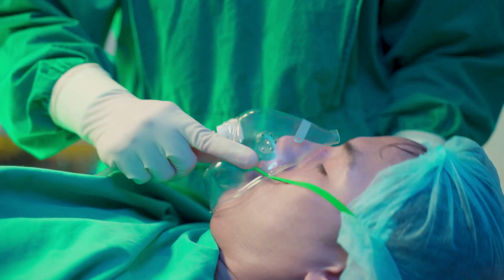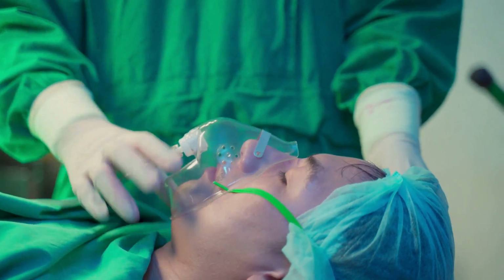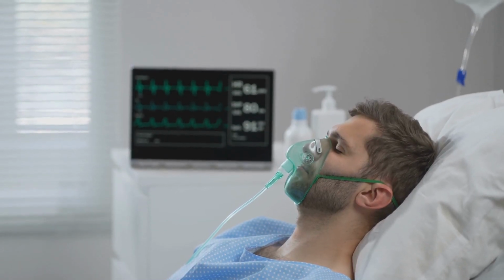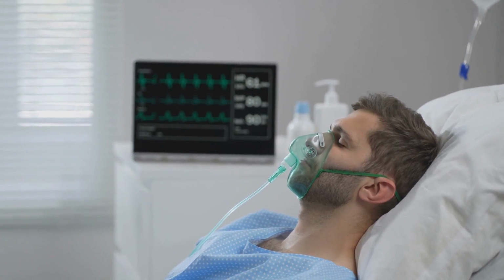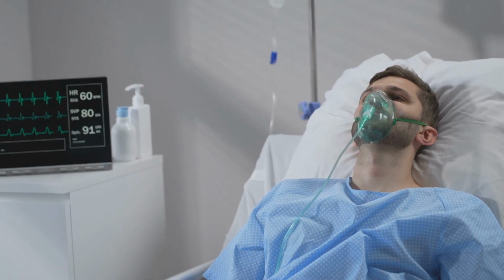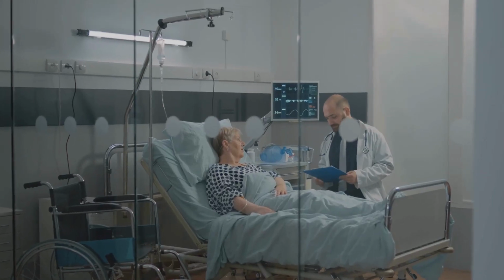We've explored the various indicators that guide us towards opting for this technique, from anatomical abnormalities to a history of difficult intubations. However, as with any medical procedure, it's not without its limitations. Certain contraindications might make it less suitable. These relative contraindications include severe respiratory compromise and uncooperative or agitated patients. It's a balancing act, weighing the risks against the potential benefits.